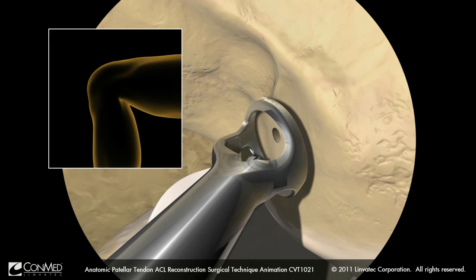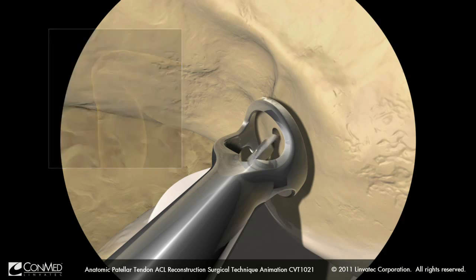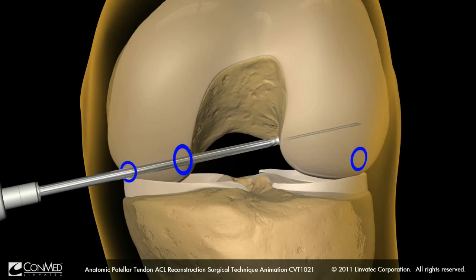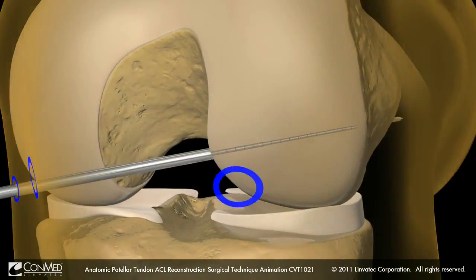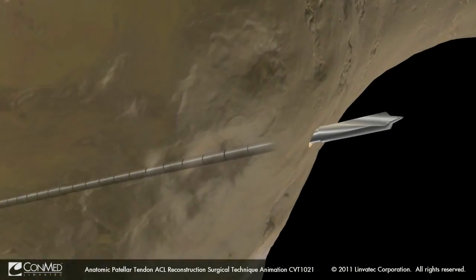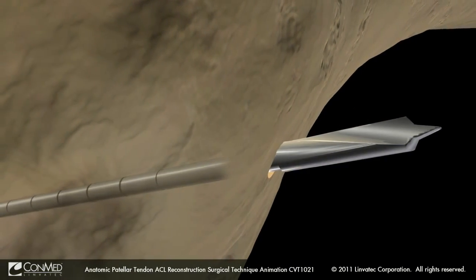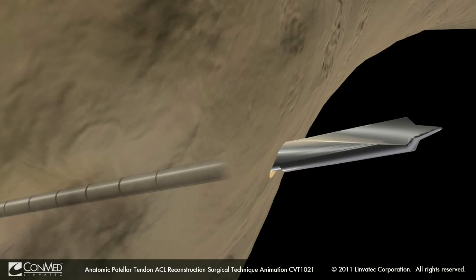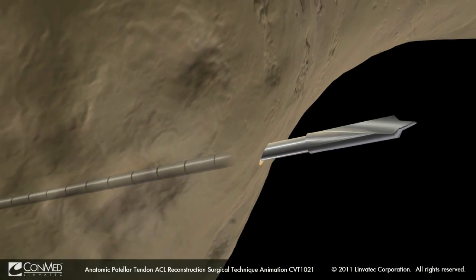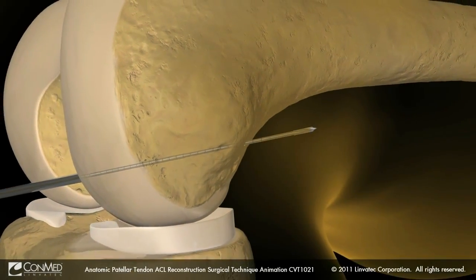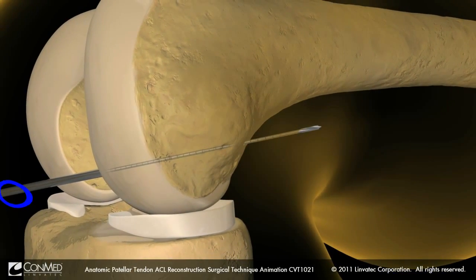Using the guide to position the exact pin, hyperflex and elevate the knee, then advance the exact pin through the lateral cortex and skin. Using the exact pin as you would a standard depth gauge, manually pull back to hook the head on the external femoral cortex to confirm the aperture to cortex length. Advance the exact pin so that the neck down portion is outside of the skin laterally and the pin is tight in the femoral tunnel.